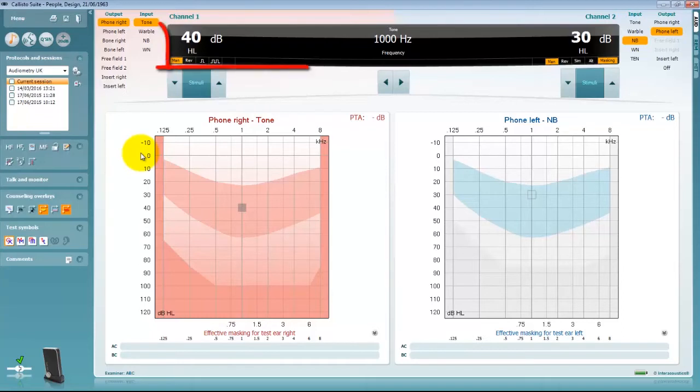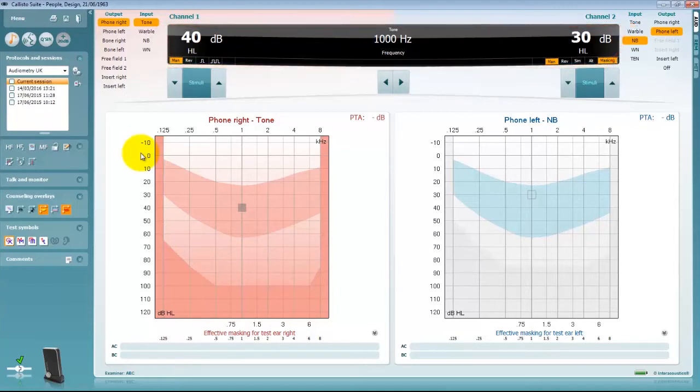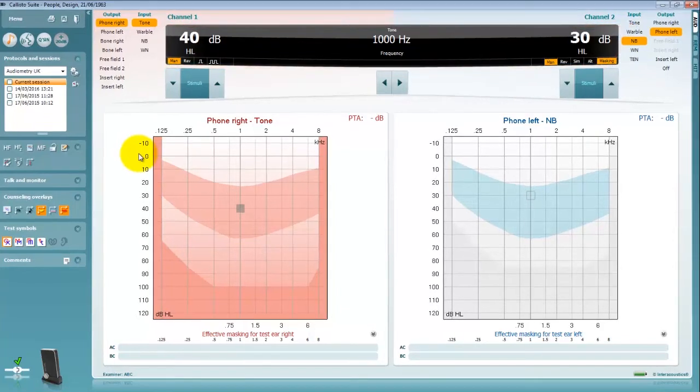The black box in the centre of the screen is central to your testing. This indicates both channel 1 and channel 2 and how they are performing in relation to your stimulus.